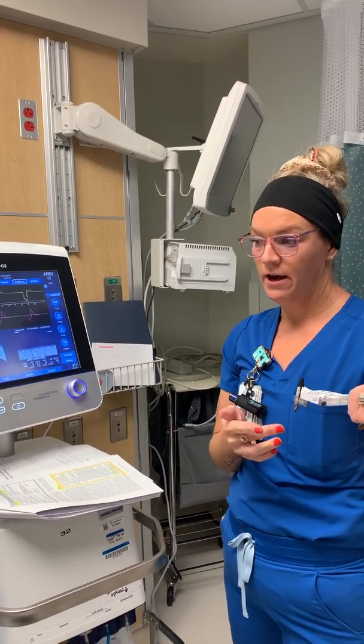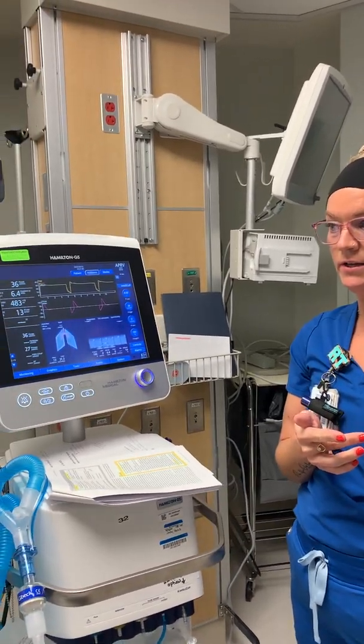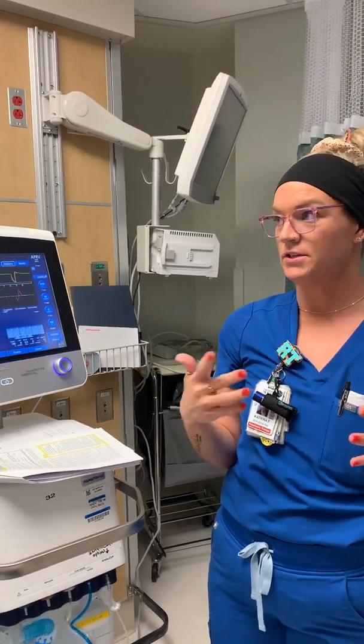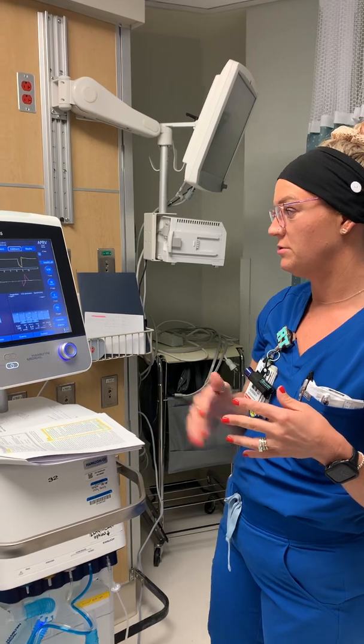There are reference cards available — check Coletta or Molina. They give you a quick guide on what changes to make if the patient is too hypercapnic or still hypoxic, as far as adjustments go.